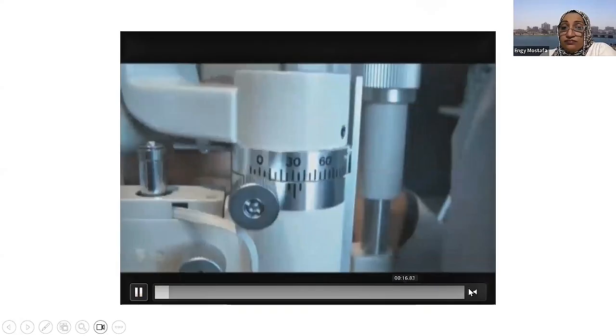Now we can find that there are many devices in the market which can evaluate dry eye degree. But I think that slit lamp examination is still the main tool for evaluating dry eye. Can you tell us about this topic?